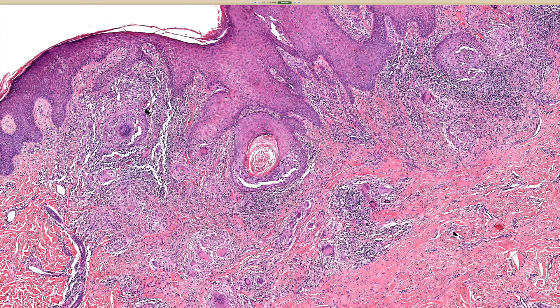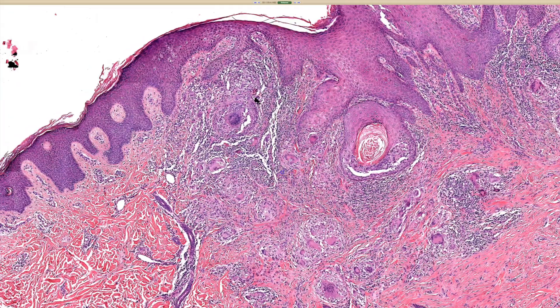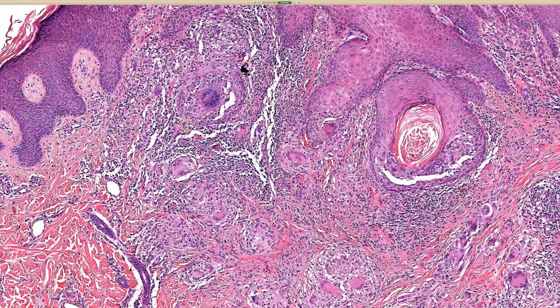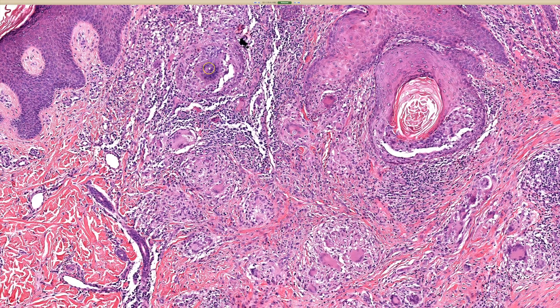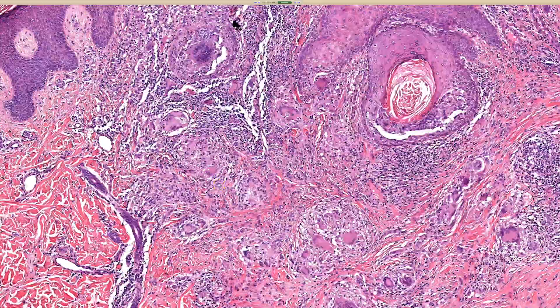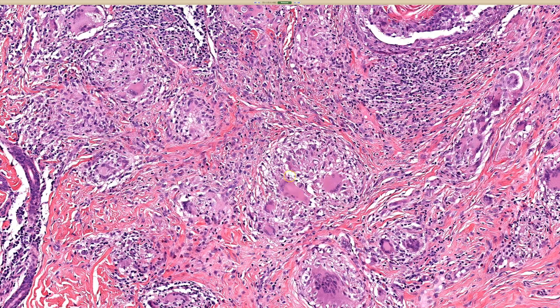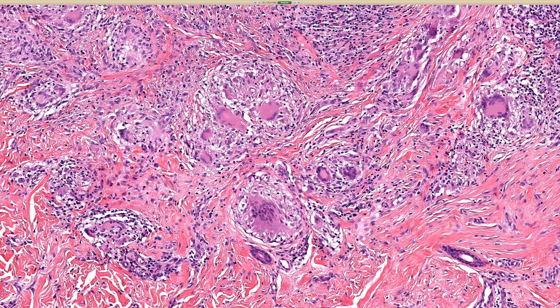A hair follicle there. And some giant cells — let's see some giant cells, maybe a lot of lymphocytes.